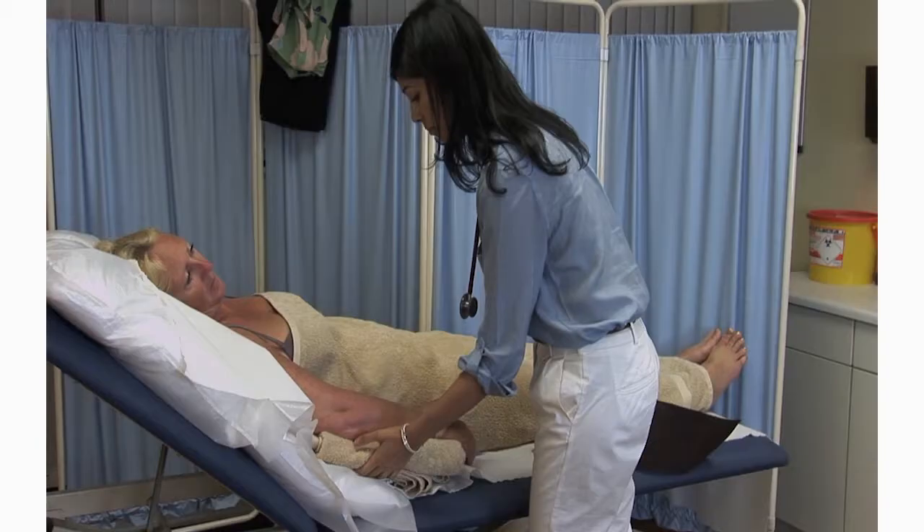Blood pressure can also be taken sitting with the arm resting on the desk. Place a cushion under the arm or adjust your chair, if necessary, to ensure that the arm is at the level of the heart. In the lying position, again ensure that the arm is at heart level, either supported by a pillow or cradle their arm by your side so that the patient is not contracting their muscles.